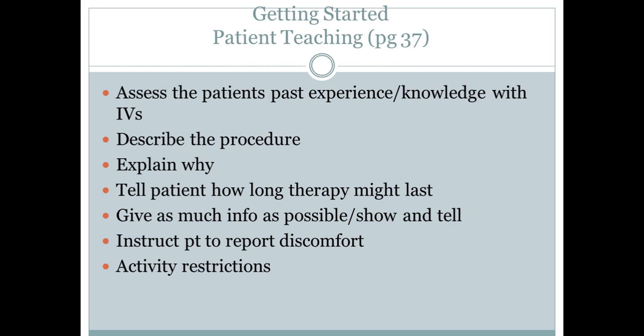So just some things to consider, and again, check with your facility policy. Most facilities will have items in place, or you can ask other nurses on that. In the shower, too, even if the IV is locked off, you still have to cover that IV site. You can't just expose it to the water.